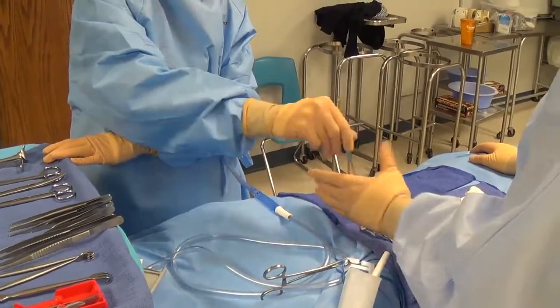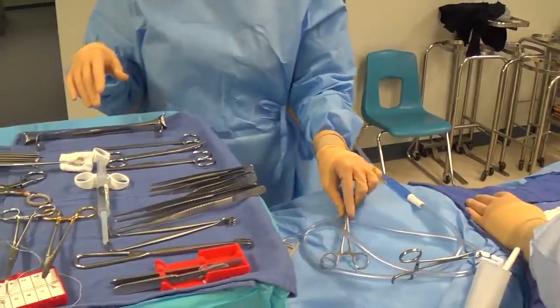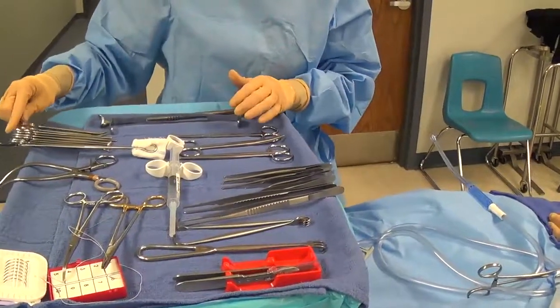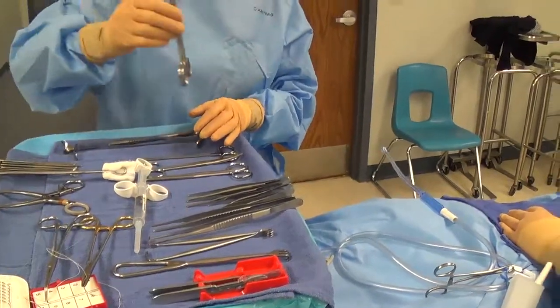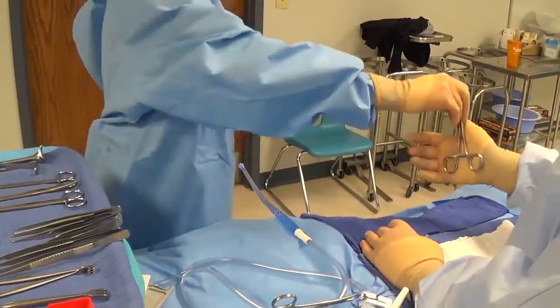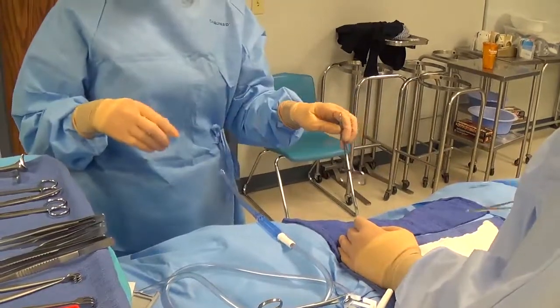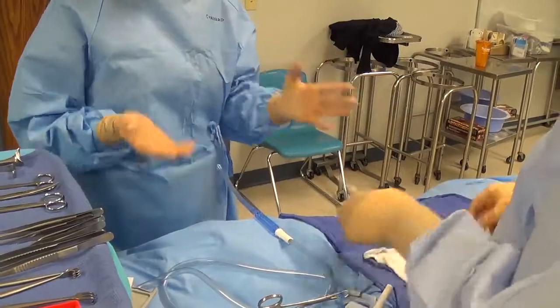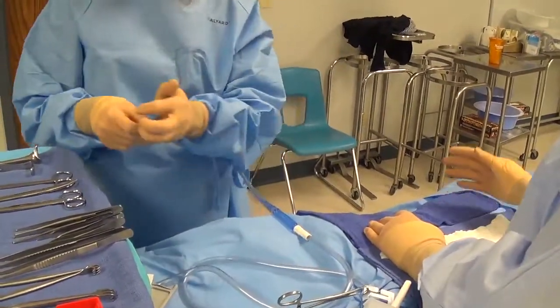When surgeons are done with ringed instruments they'll often just lay them down on the field. They're not sharp, but it is your responsibility to pick up instruments from the field and put them back exactly where they came from on the Mayo stand, so you know where to find them when the surgeon asks again. If a surgeon asks for two instruments like two Kellys at the same time, hand them one at a time — the surgeon may take them in the same hand or opposite hands depending on placement in the field.